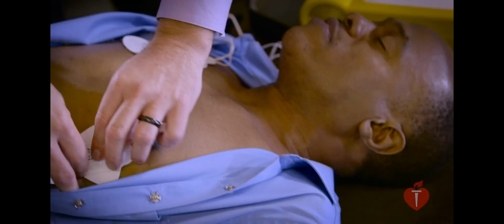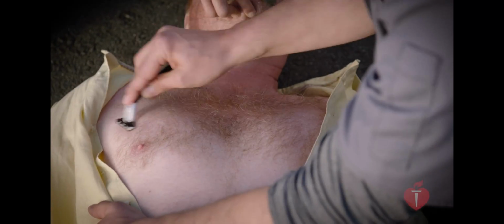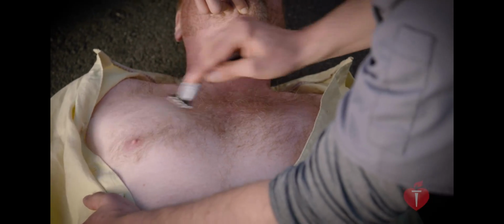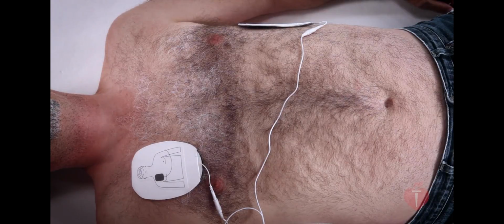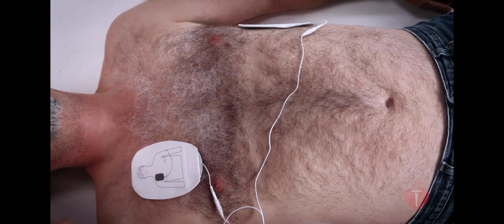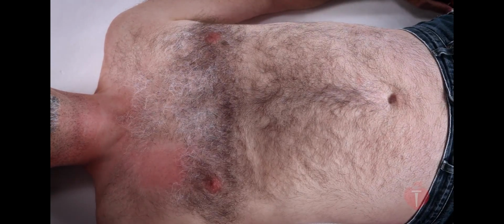You'll need to consider a few special situations when using an AED. First, if the victim has hair on his chest, the hair may prevent the pads from sticking. If your AED has only one set of pads, a razor should be included. You can use the razor to quickly shave the area and then apply the pads. If your AED has two sets of adult pads, you can apply one set to the hairy chest. If the hair prevents the pads from coming in contact with the chest, the AED should tell you to check the pads. If it does, press the pads down more firmly. If they still aren't sticking, rip the pads off forcefully, removing the chest hair. Then reapply a new set of pads to the bare skin.